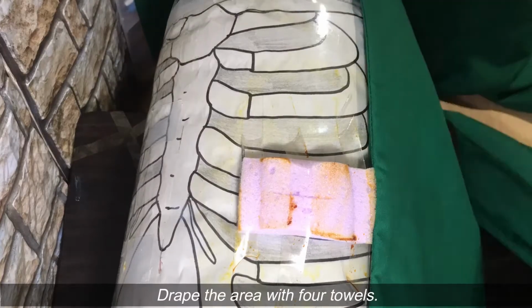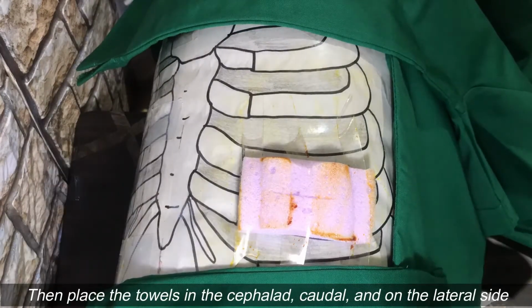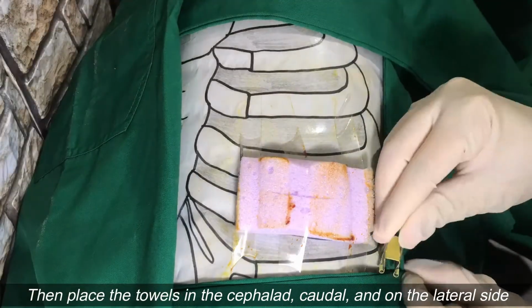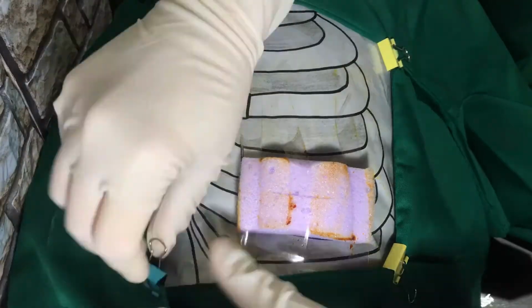Drape the area with 4 towels. Place the first towel on the side nearest the surgeon. Then place the towels in the cephalad, caudal, and on the lateral side opposite the surgeon. Secure the drapes with towel clips.